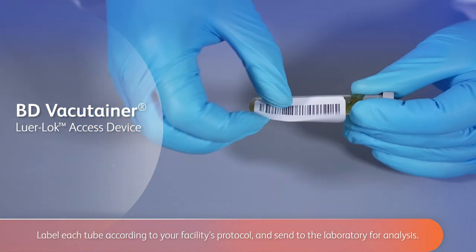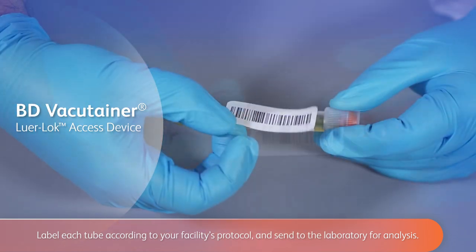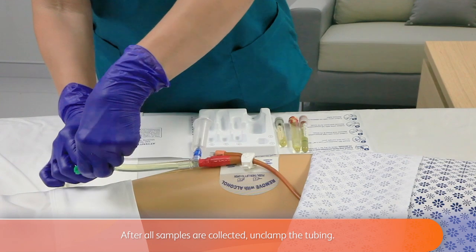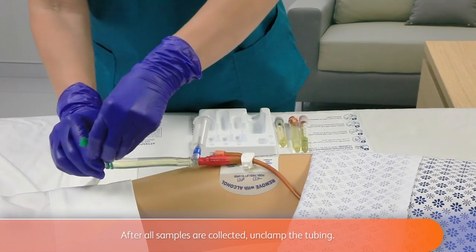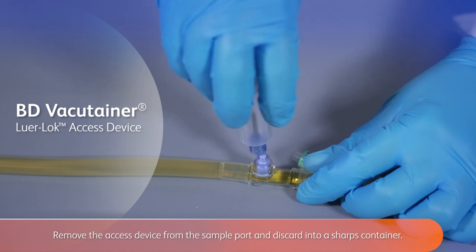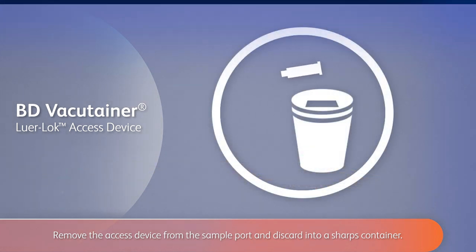Label each tube according to your facility's protocol and send to the laboratory for analysis. After all samples are collected, unclamp the tubing. Remove the access device from the sample port and discard into a sharps container.